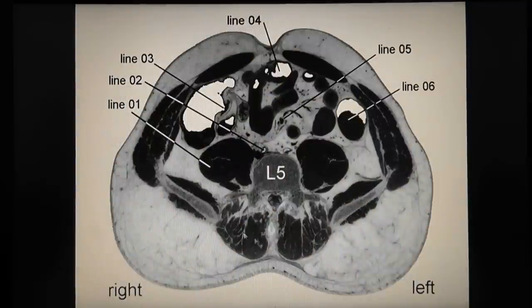If we do a transverse section through the body at L5, with the buttocks down and umbilicus up, you need to get to the spinal canal to open it up. You can't go through the side because the pelvis is in the way; you can't go through the belly because of the intestines. The easiest way is through the backside. This cadaver shows very robust lumbar musculature. When you spread muscles apart they can die, so I minimize that by going on one side and moving the retractor so pressure on the nerves is never excessive.